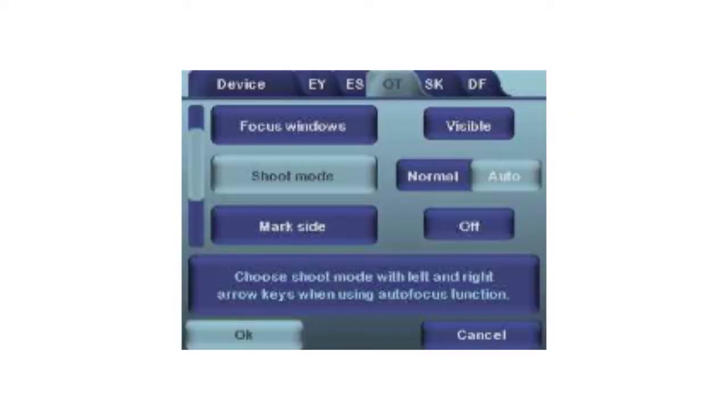With the auto shoot mode, you will only need to press the shutter button halfway down, and the camera will automatically focus and take the image.